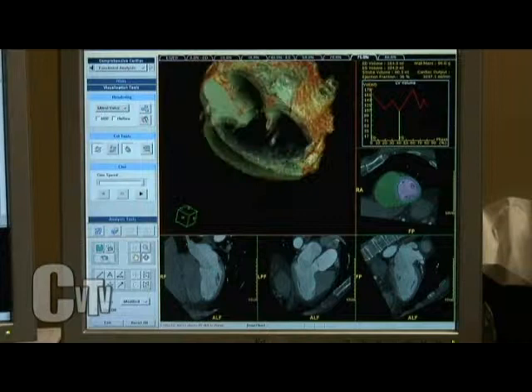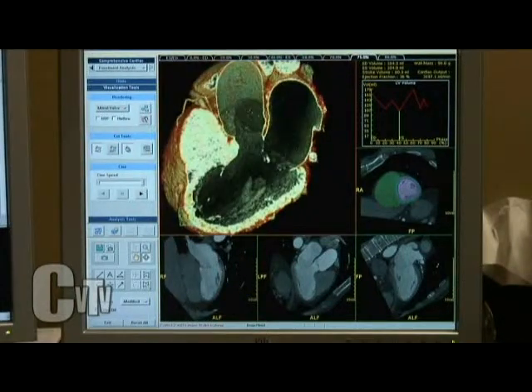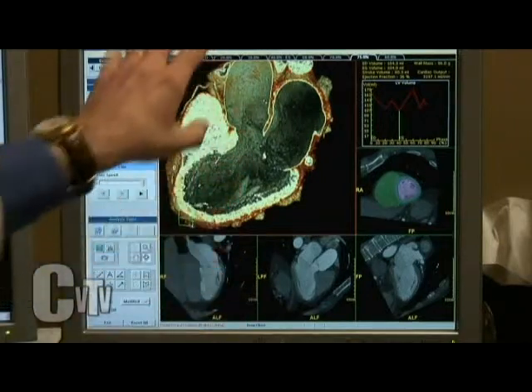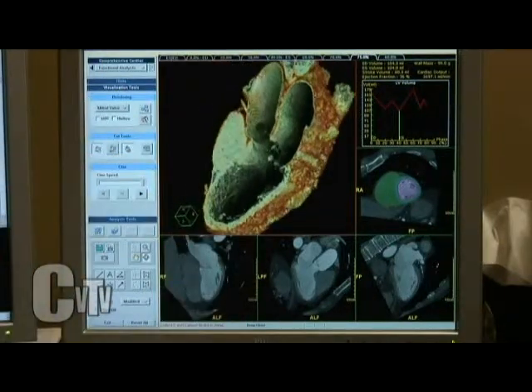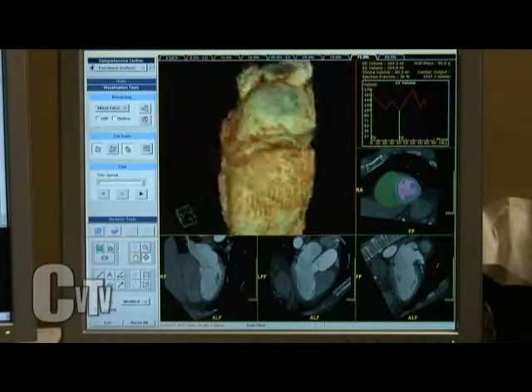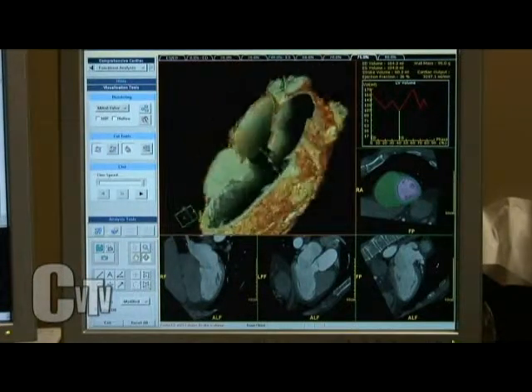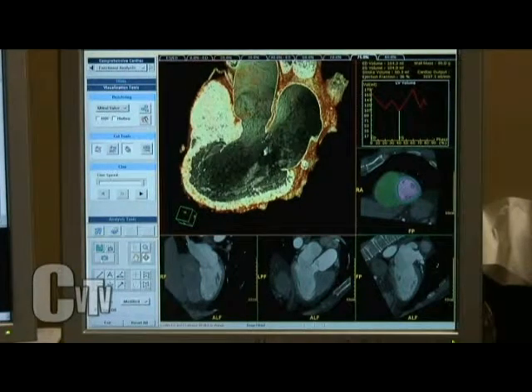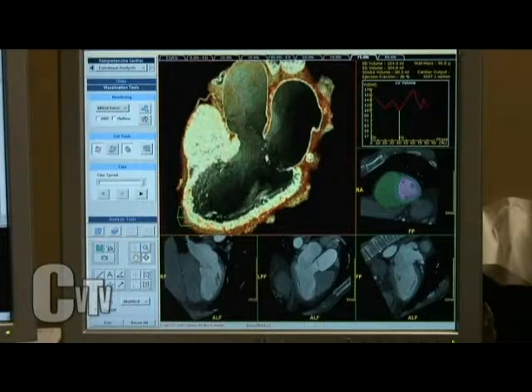We can look at that from the top and the bottom. Again, aortic valve here. This is the inside of the aorta, so this is that major 30-millimeter vessel that comes out of the heart, and that's what it looks like on the inside. That little dimple right here is actually the origin of the right coronary artery that we looked at before. So that's the origin of that vessel as it comes off the aorta. And again, there's the left ventricle and the inside of that left ventricle here.